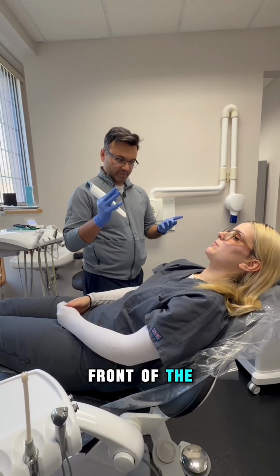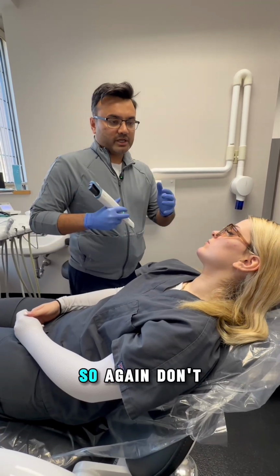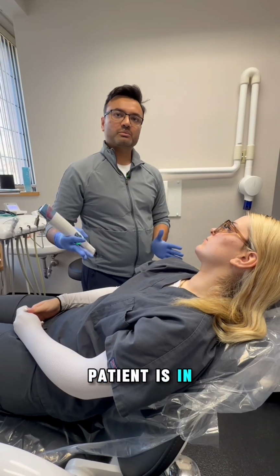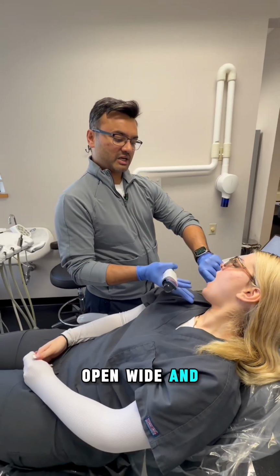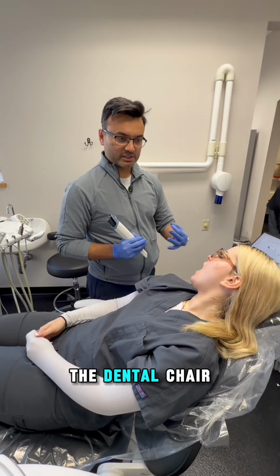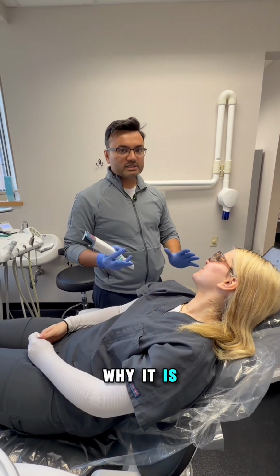Now, stand in front of the patient, tell the patient, turn towards me a little bit, please. So again, don't go like this, have the patient turn. Patient is in a more comfortable position, I am more comfortable, turn slightly towards me, open wide, and I'll tell the patient always. It's a very common tendency for patients when they're in the dental chair that they're gonna go like this. I don't know why. It is just a thing.